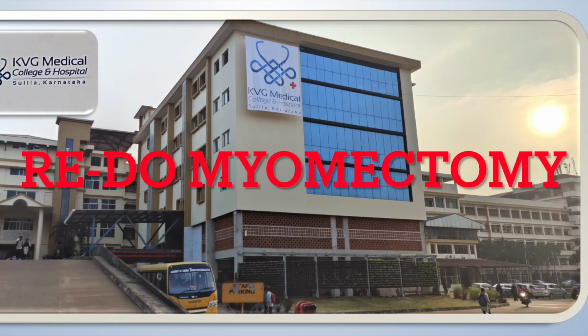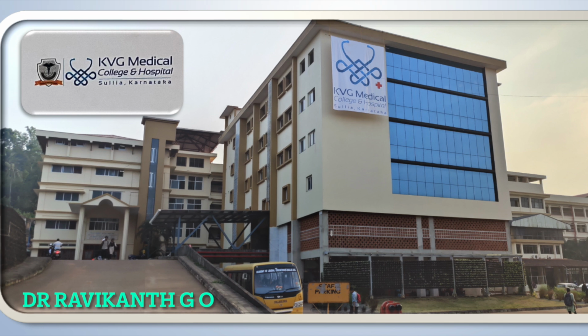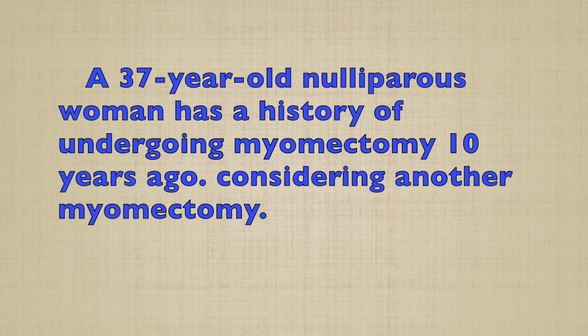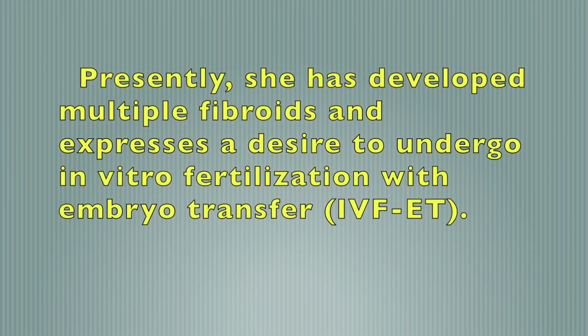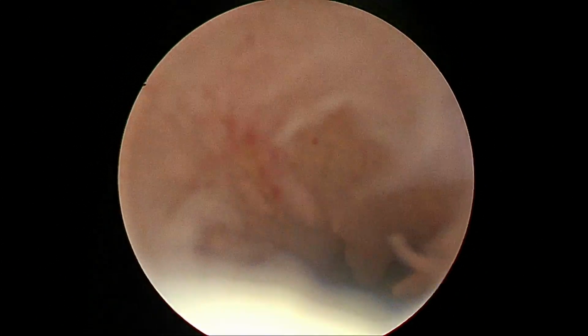Hello friends, I am presenting a case of redo myomectomy. A 37-year-old nulliparous woman had a history of myomectomy done 10 years back. Now she has multiple fibroids and wants to undergo IVF, and her consultant advised myomectomy before going for IVF ET.